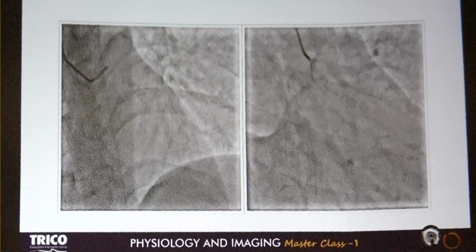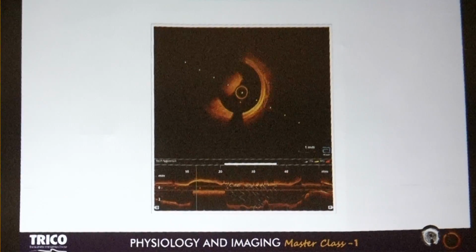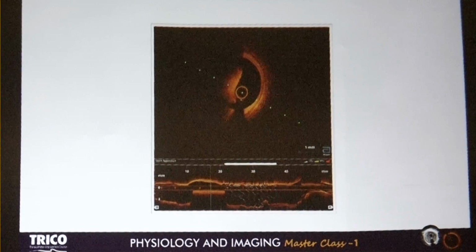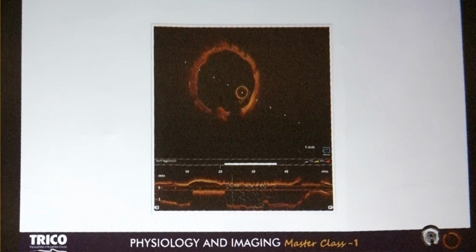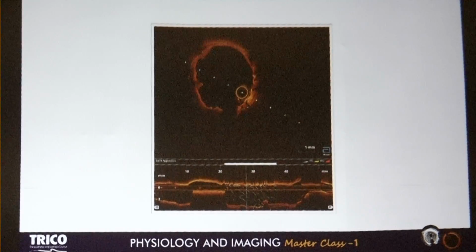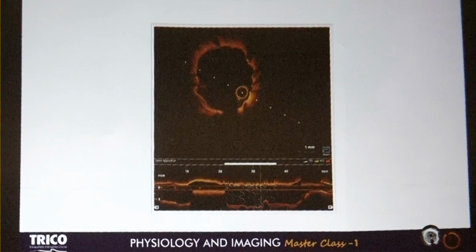See this horizontal plane of the OCT. Proximal end of the stent. Measurement over here can give an idea of how much is the MSA compared to distal or the mid part of the stent. So that's a predisposing factor to have a thrombus formation.